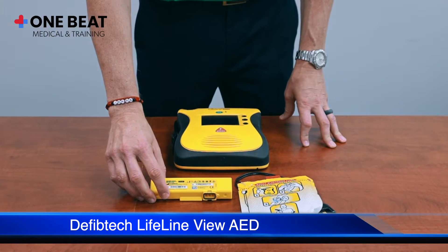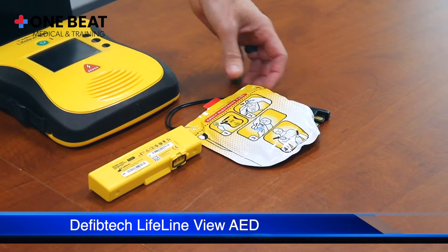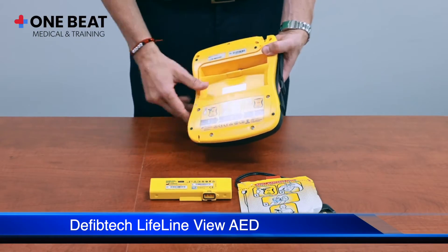Here is your battery, and you also have your adult electrodes. The battery is placed on the underneath side.